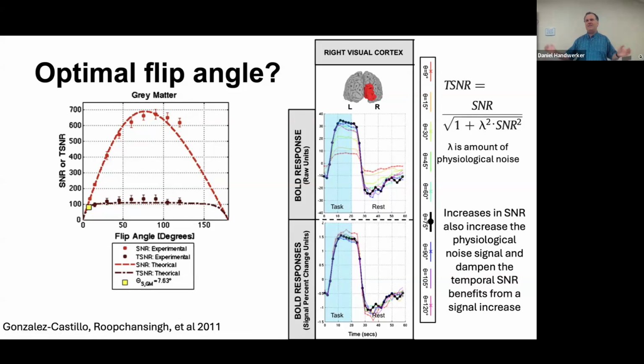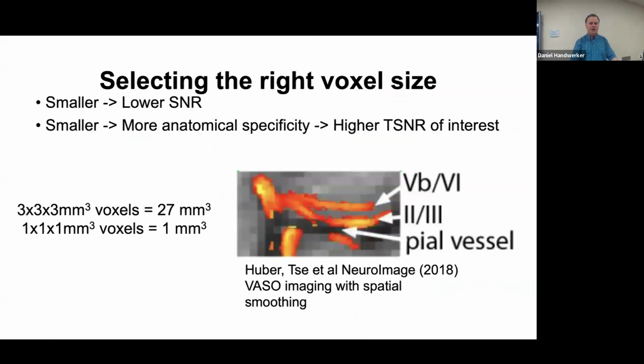And like I said, most people don't have to think about flip angle, partially because of this, but it's just an example of something that, at first glance, SNR is good, but it turns out it doesn't matter as much as you might think.